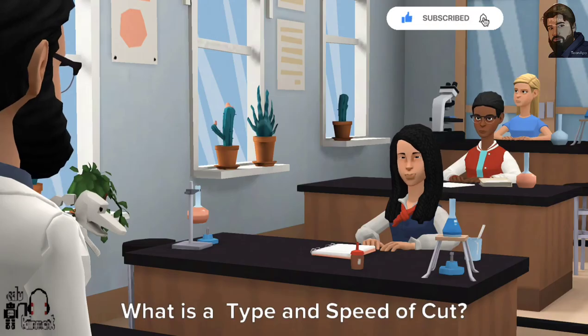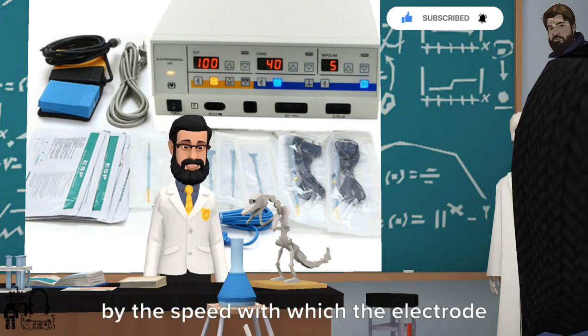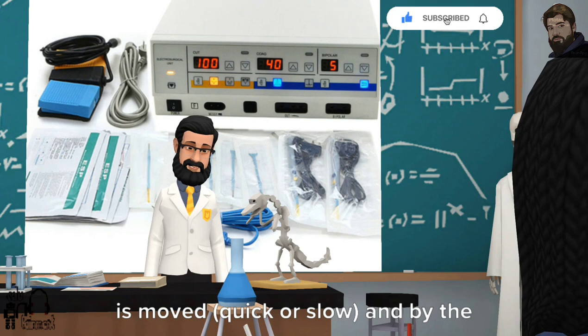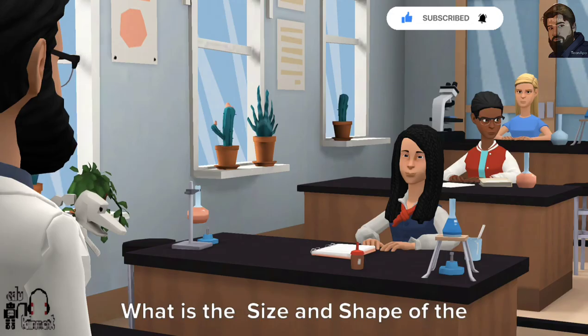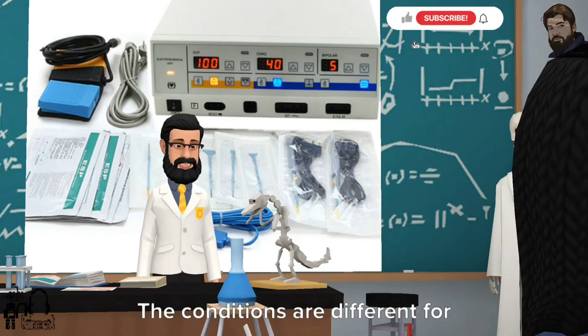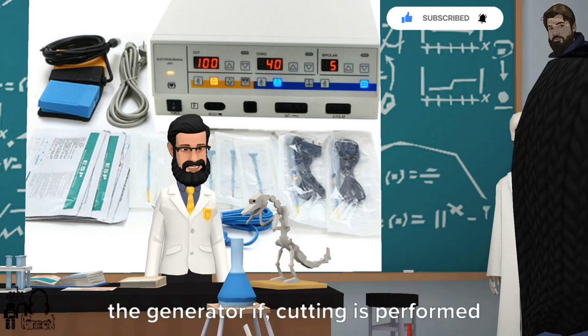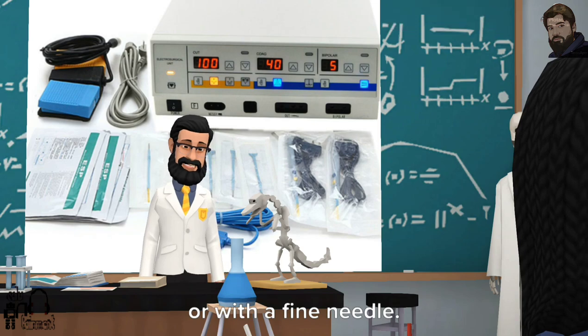What is the type and speed of cut? The cutting quality is determined by the speed with which the electrode is moved, quick or slow, and by the type of cut, superficial or deep. What is the size and shape of the cutting electrode? The conditions are different for the generator if cutting is performed with electrode of large surface area or with a fine needle.